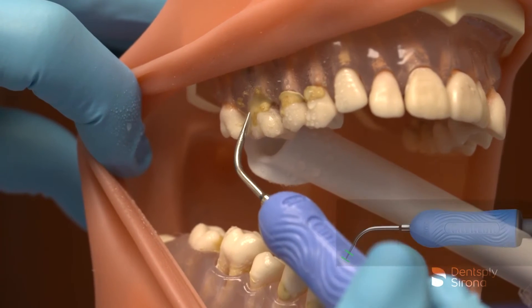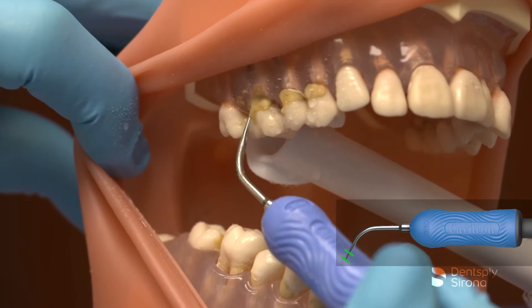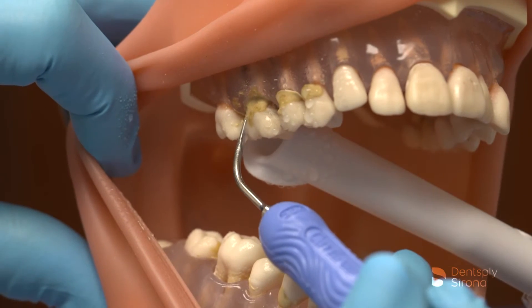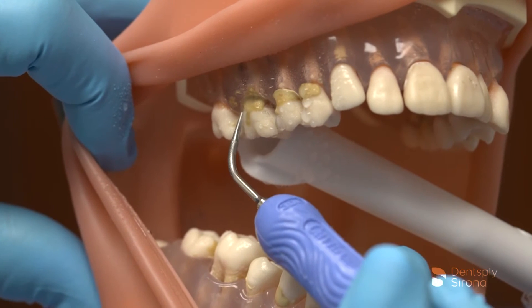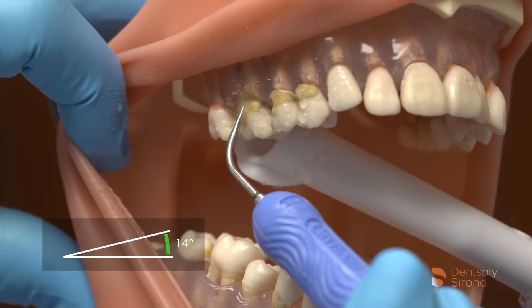The clinician adapts 2-3 mm of the terminal end and rides the anatomy towards the gingival margin in a vertical oblique orientation while maintaining an angulation of 0-15 degrees.